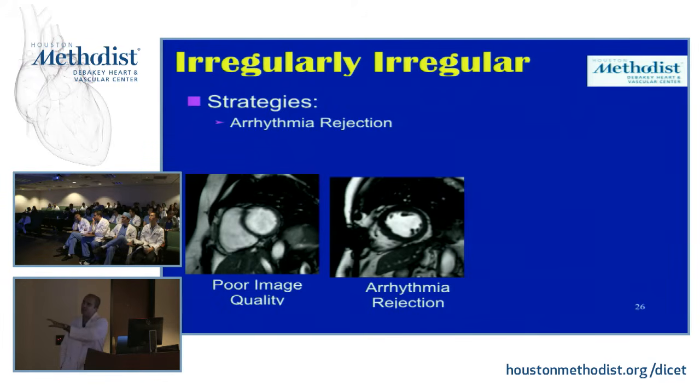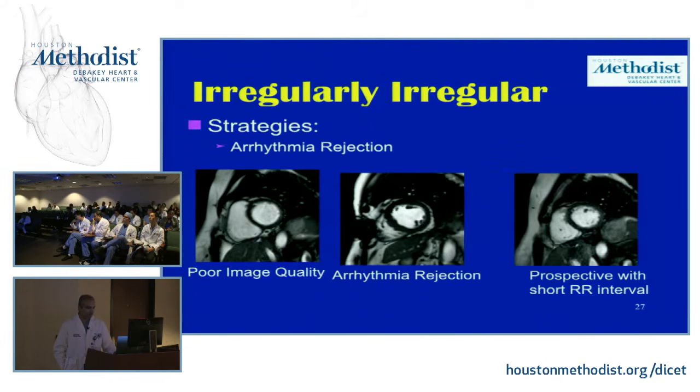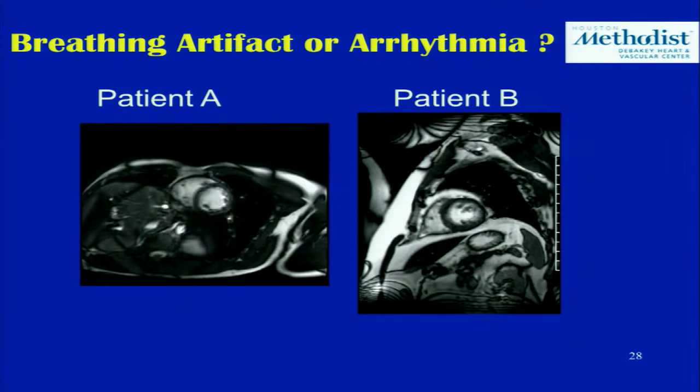It's a very nice setup, because this strategy works best if you're having some occasional ectopy. If you have a lot of ectopy, it's not going to work. If you have AFib, where there's a lot of physiologic variability, that's not going to work as well. In those cases, I'll show you what we will typically do. Actually, that's coming up in a second.